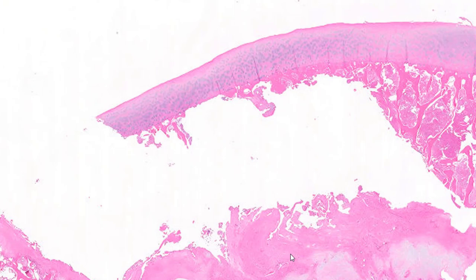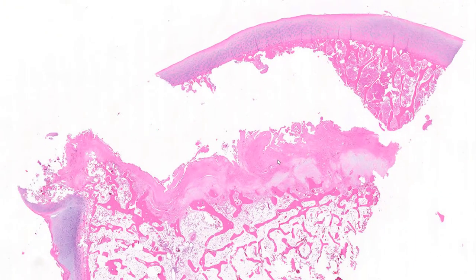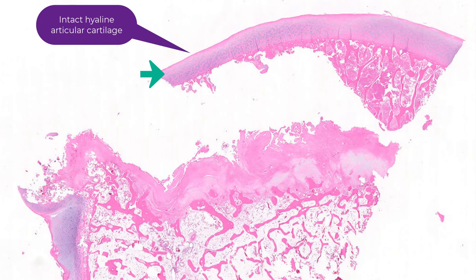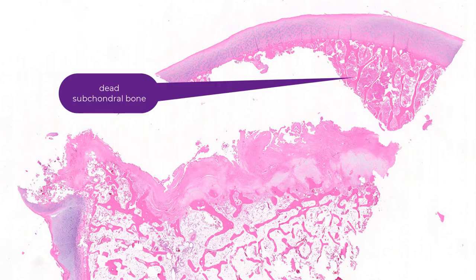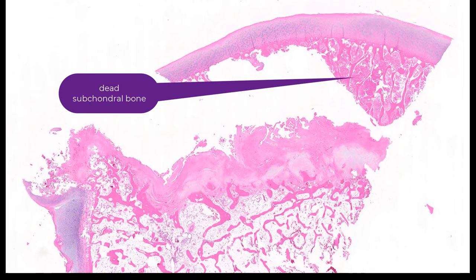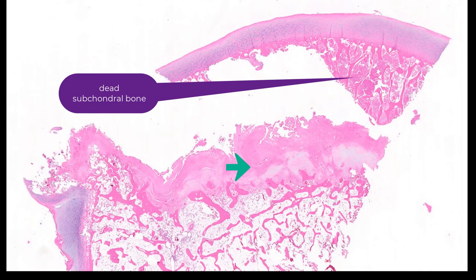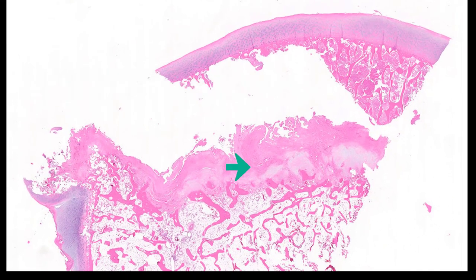This is a very typical low-power appearance of avascular necrosis. You'll see three layers essentially. The first layer is the intact articular cartilage that is alive. Right under that, the subchondral bone is dead. And the third layer, a distance away, is the interface between the dead bone and the living bone.